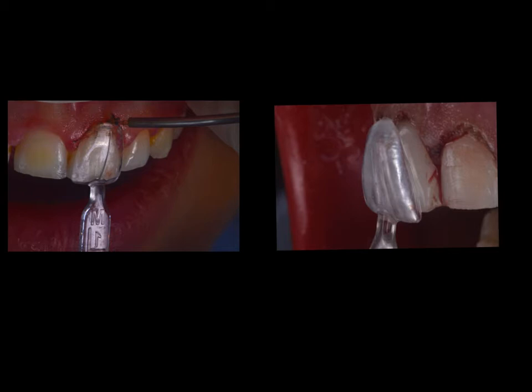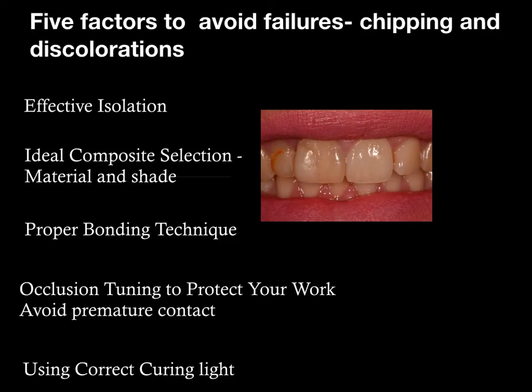Of course, be aware of the biological width, and if it's violating the bone and the biological width, of course, send it to the periodontist with the Uveneer even to show them where you're gonna get.